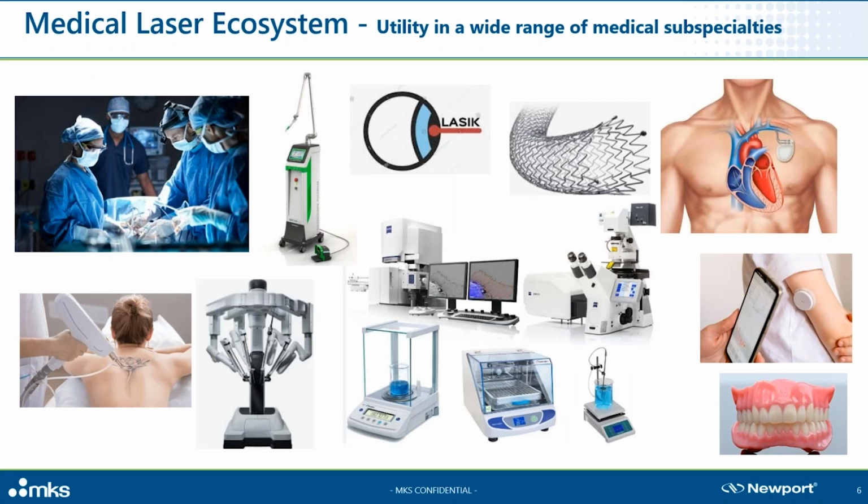So this goes to show the evolution of a singular field in medicine through advancements in technology. Today, lasers have infiltrated nearly every aspect of the medical ecosystem. Surgeons perform exploratory surgery using lasers to see, cut tissue, and cauterize bleeding.